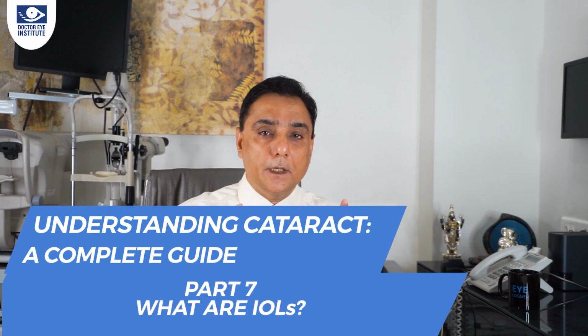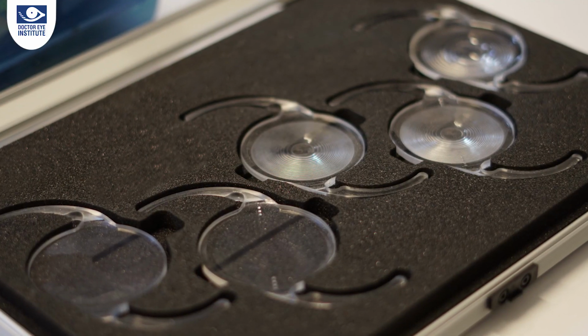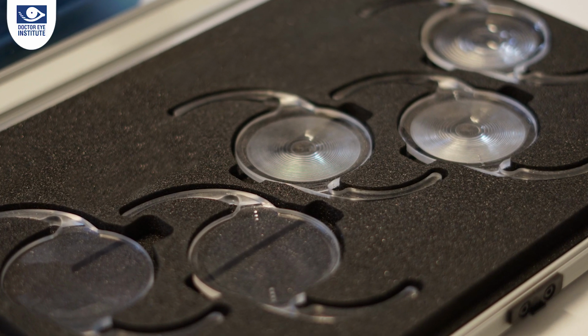Now today's episode is all to do with intraocular lenses, their origin, what they really are, and their history. So friends, we've come a long way in understanding the disease of cataract. In my past episodes, I've discussed symptoms, signs, and management of cataract. So now it is time that we turn our attention to the intraocular lenses which get implanted once the cataract is removed. This is the most important step of cataract surgery.